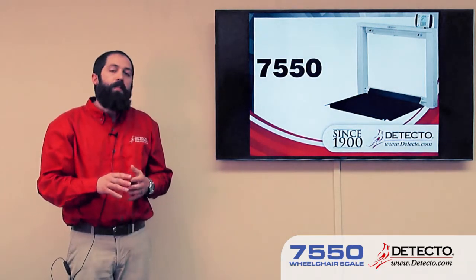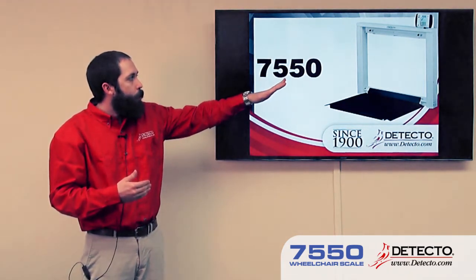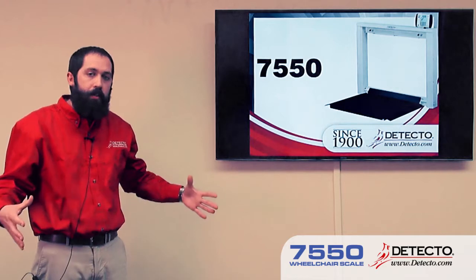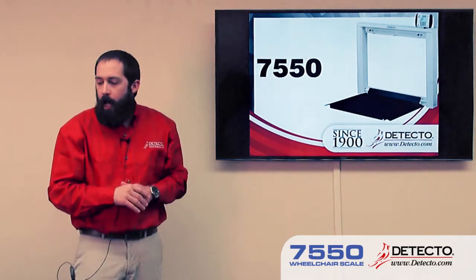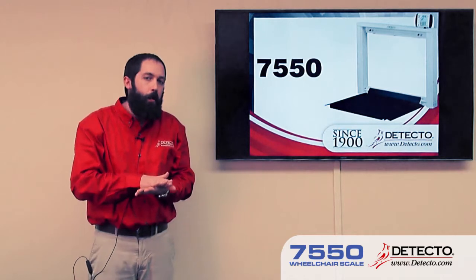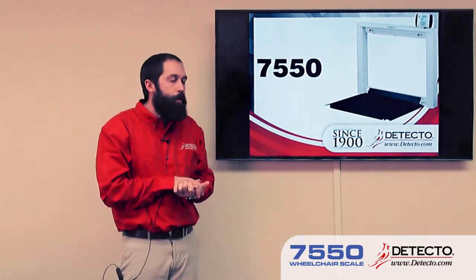Starting with the 7550, this is our wall mount wheelchair scale. As you can see, it mounts on the wall and then the wheelchair platform folds down. So when it folds up, it's a nice low profile — you don't have the scale sitting in the middle of the floor all the time, and it's stored out of the way. The weighing platform is very low to the ground. It uses a very flat load cell, which allows us to get it very close to the ground compared to our other scales.